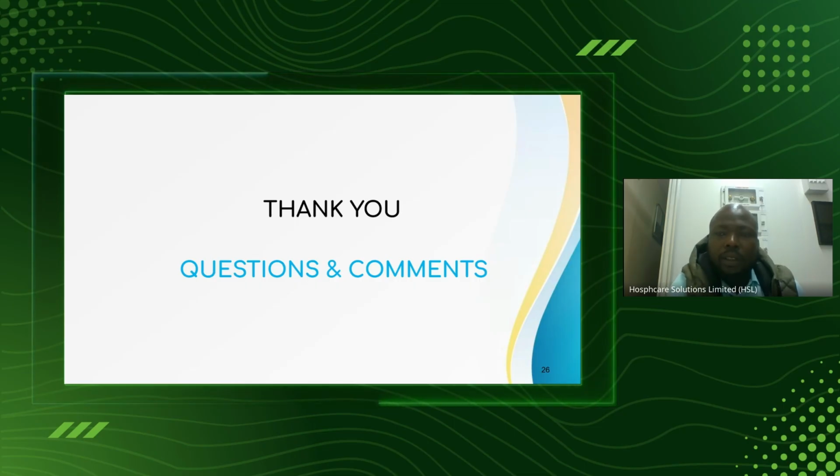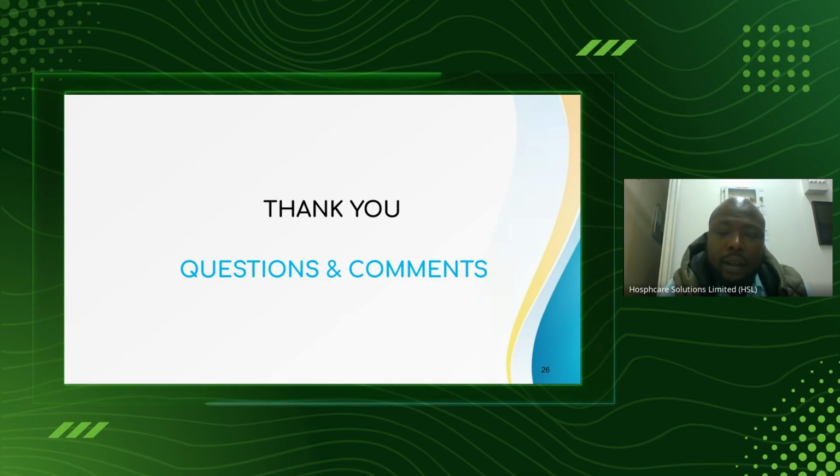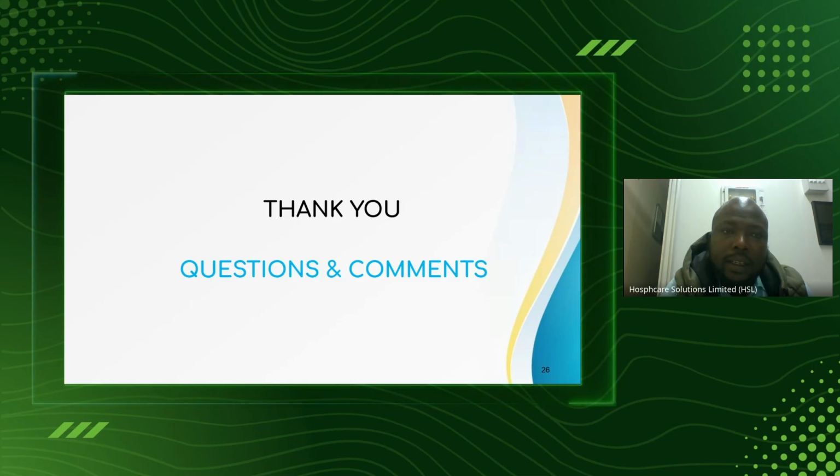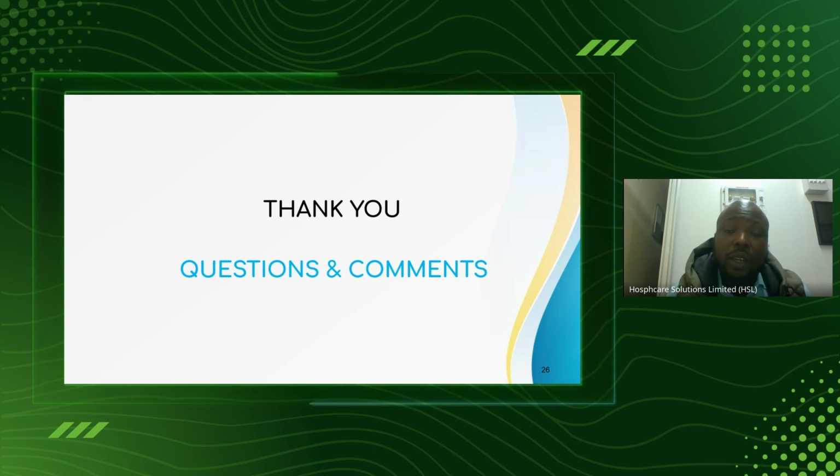Thank you, Asante, for the question. Well, during the leak test, I don't expect you to open the whole length of the tubes at every point. So what you need to do is identify the input line, that is from the compressor to the dental unit point. That is where you'll attach your instrument.